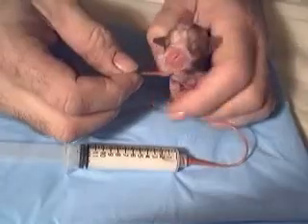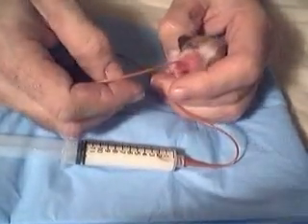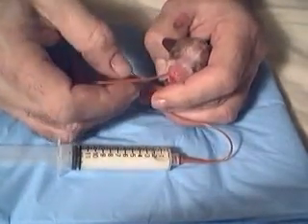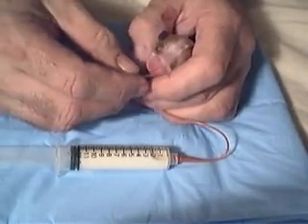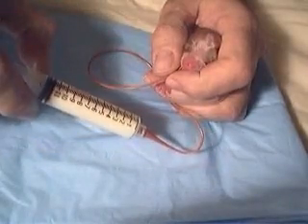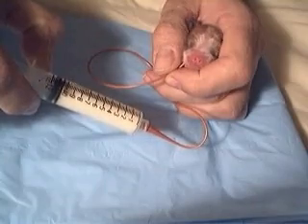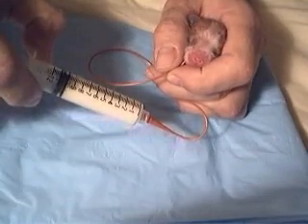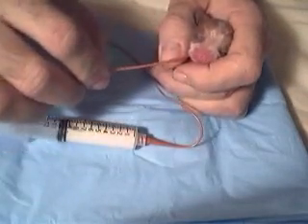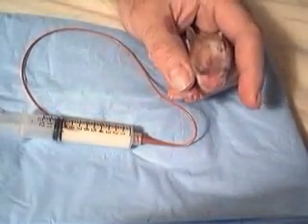You see how he's swallowing? See the tongue moving? Put the tube down close to that mark. I'll show you the mark in a minute. I'm holding it, and I'm giving very slowly. I'm at 1 ml. I'm at 2 mLs. I'm at 2.5 mLs. Take the tube out gently, and basically that was it.